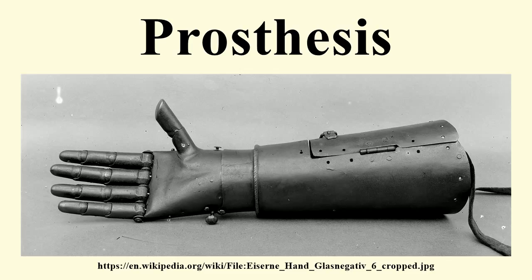Craniofacial prostheses include intraoral and extraoral prostheses. Extraoral prostheses are further divided into hemifacial, auricular, nasal, orbital and ocular. Intraoral prostheses include dental prostheses such as dentures, obturators, and dental implants. Prostheses of the neck include larynx substitutes, trachea and upper esophageal replacements. Somatoprostheses of the torso include breast prostheses which may be either single or bilateral, full breast devices or nipple prostheses.